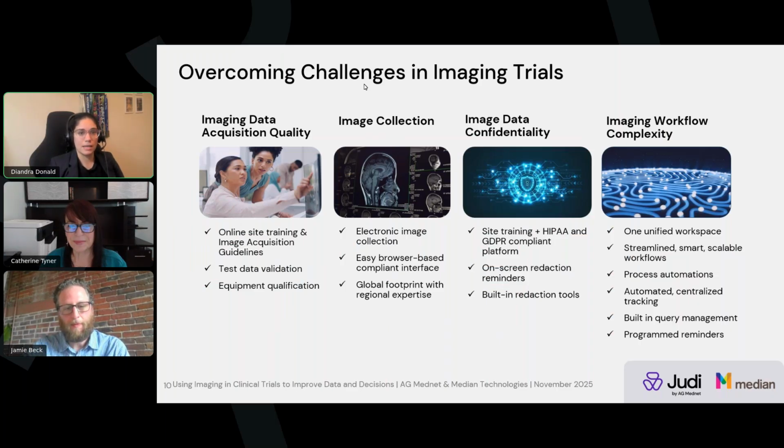Depending on the study and the image acquisition requirements, it may also be important to perform a qualification process for the site's equipment that will be utilized to produce test study data before the site starts acquiring any patient images. This extensive training process allows the core lab to address any potential technical or acquisition issues in order to prevent downstream delays on reads, patient outcomes, and trial timelines.